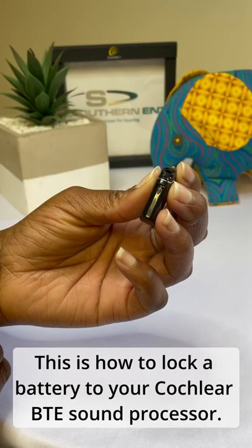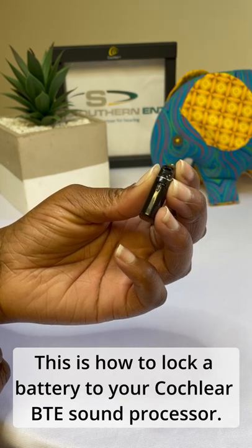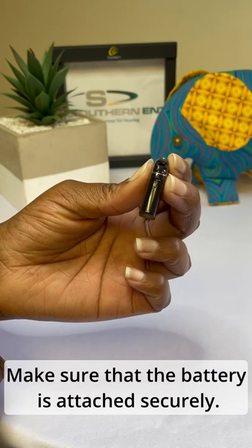This is how to lock a battery to your cochlear behind-the-ear sound processor. Make sure that the battery is attached securely.